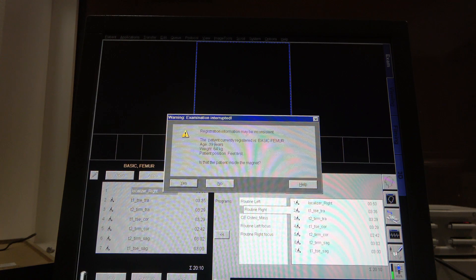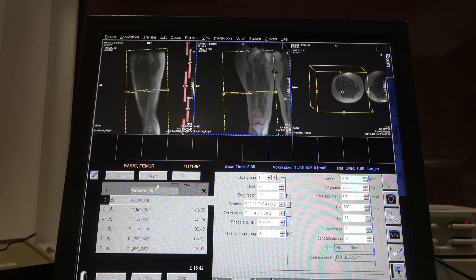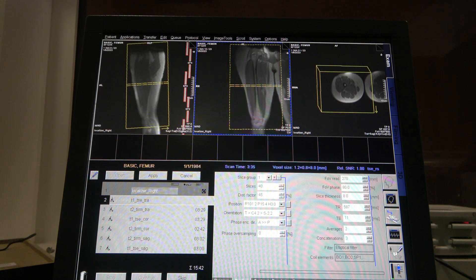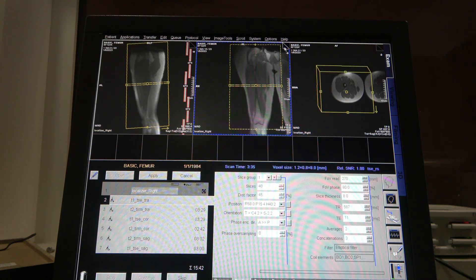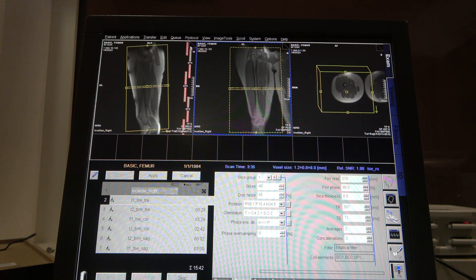This is just telling you, once again, making sure everything is correct. This mostly happens when a patient has more than one study. So here's our localizer — scout, whatever you want to call it. Make sure we got everything here. It's losing signal up here as you can see, so we'll move it down a little bit. You can even cut down some slices. Remember, if you're able to do joint to joint, that's the best. If you can't get joint to joint, just make sure you get one.